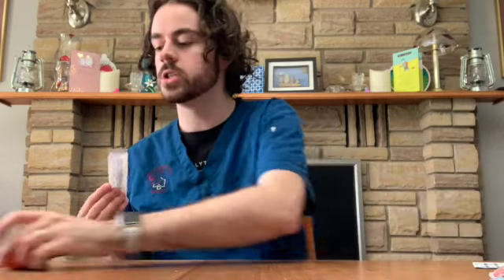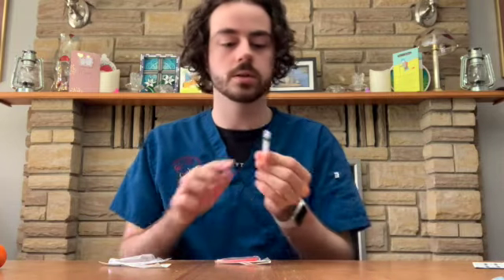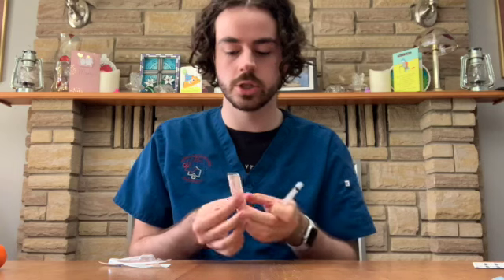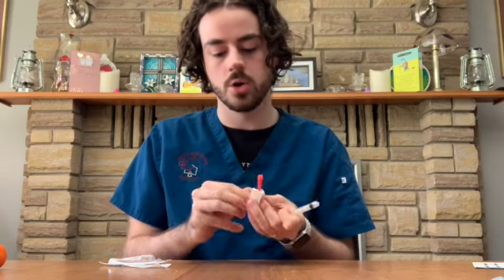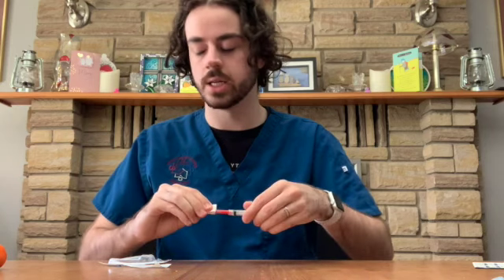So for my medication order here, I have Haldol 1 milligram intramuscular, and our supply is Haldol 4 milligrams per 2 milliliter vial. So that means that I will be needing 0.5 milliliters of medication. I'm going to start by prepping my syringe with my blunt tip needle. Same way as last time, I'm just going to open my syringe. This end is sterile, so I'm going to ensure to not touch it. Open up my blunt tip needle like a banana peel, and these two pieces can attach together just like that.